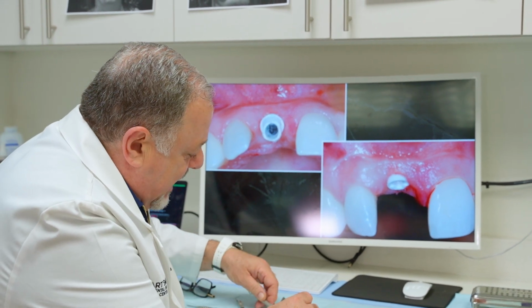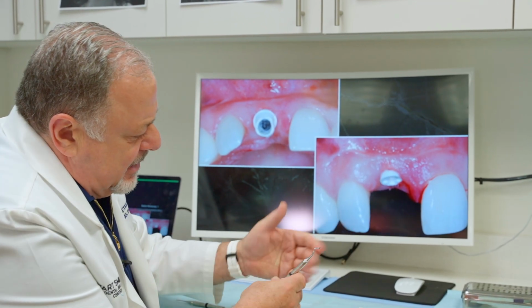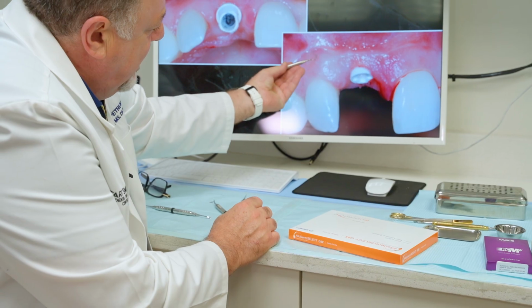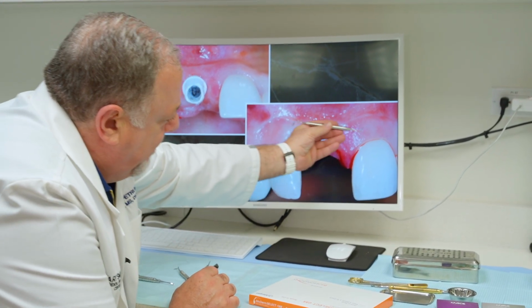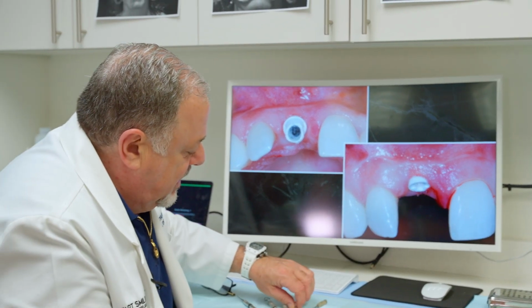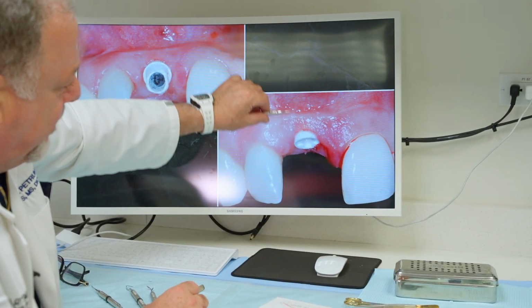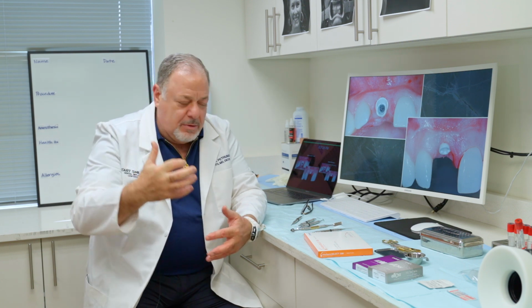Then I'm going to go in with a long Orban knife, okay? You can see the double edge. It's about 1.5 times the length of the regular Orban knife periodontal instrument. That will go up into the vestibular space, and we'll be moving it across here to free this tissue up without loosening or cutting the papilla. And then through another set of elevators, such as this, we'll be going in here and just freeing this up more. So not only are we freeing up the attached portion, we're freeing up the mucosal portion across that level of the implant so we can then advance that down.